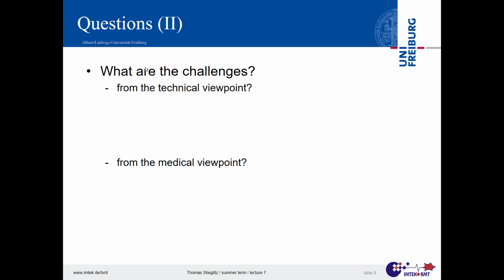if you have ever played pool billiards, you know how difficult it is to predict where the balls go when you bump into something. And this is the same with our intestine, which is viscoelastic. If you had a tiny little capsule or submarine, call it whatever, and you tried to poke something in there, how do we know that we really penetrate the wall of the intestine and this doesn't act like one of those hits in the billiard? It means our endoscope would be bounced somewhere else just by trying to poke there, with the action and reaction force that we have.